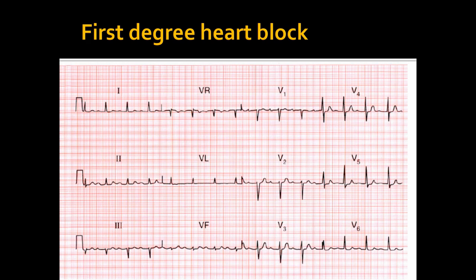So this is an ECG of first degree heart block. First degree heart block में क्या होता है बेटा? आपको सबसे पहले जस्ट हैव अ लुक एट दिस ECG और देखें कि कोई आपको एबनॉर्मेलिटी नज़र आ रही है, and just concentrate on the PR interval. So आपको बताया था कि PR इंटरवल जहां से P वेव शुरू होगी, जहां से ये पॉजिटिव डिफ्लेक्शन आना शुरू होता है, वहां से स्टार्ट होता है.